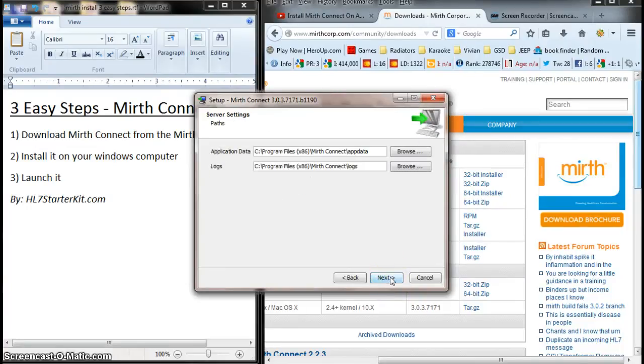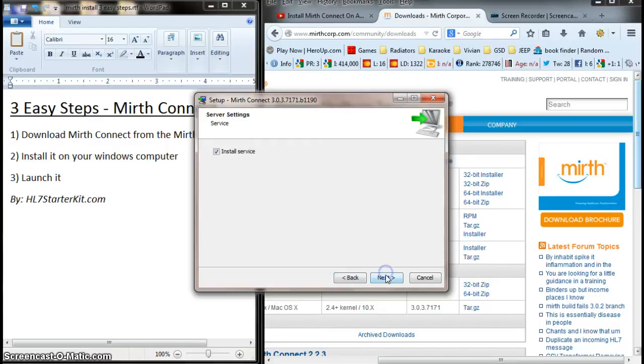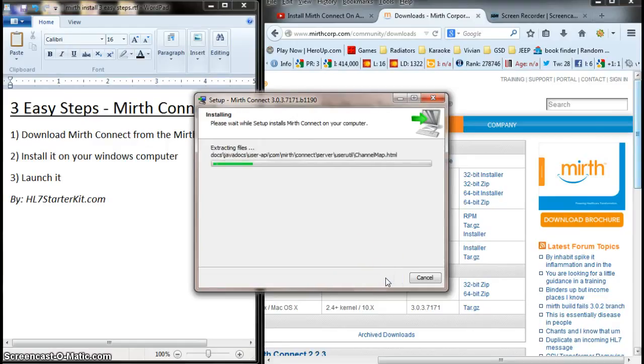Again, Next. Accept all defaults. Oh, you may want to make note of the installation path. I like to do that. Next. Yes. And there it goes.